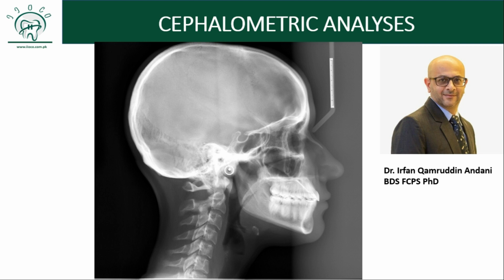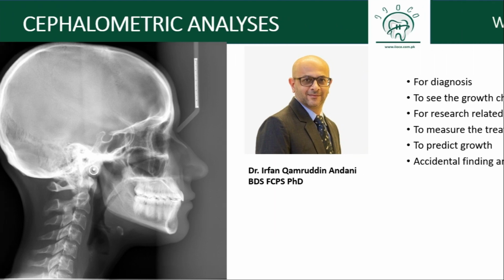Because there are more than 200 analyses available in this orthodontic world, and it is not possible for me to cover all of them, but once you have grasped the basic concept, you will be able to understand various analyses by yourself. So let's begin.